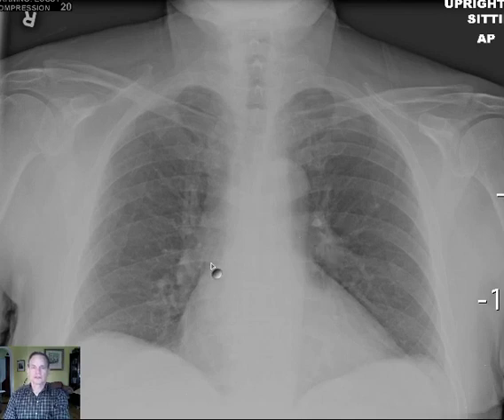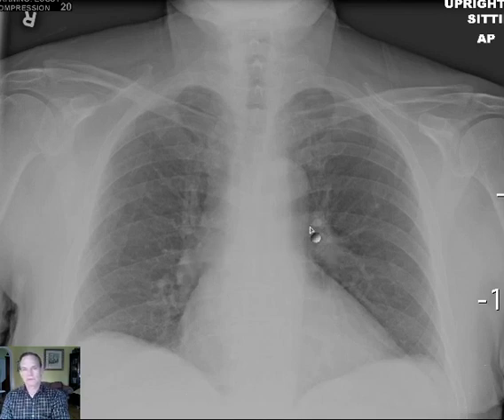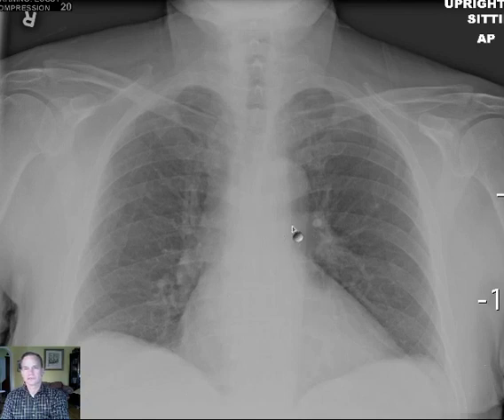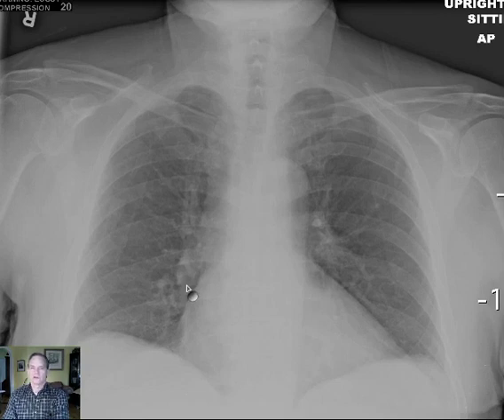I'll ask you to pay particular attention to the hilar regions. Remember, the left main pulmonary artery goes up and over the left main stem bronchus, and that's what you're seeing here and its branches, whereas the right pulmonary artery goes anteriorly and downward in front of the right main stem bronchus.